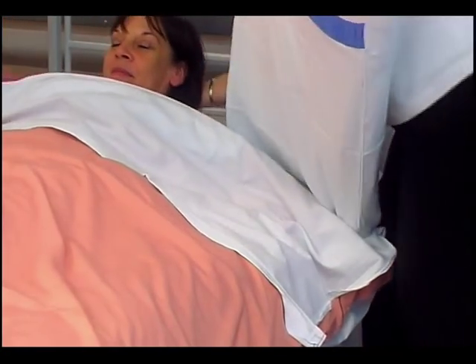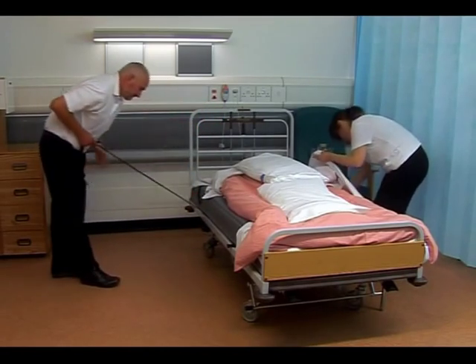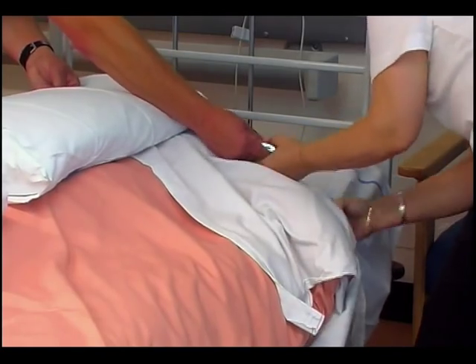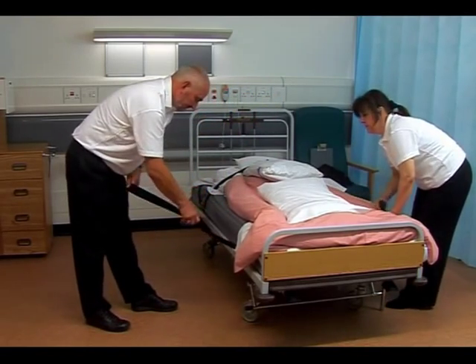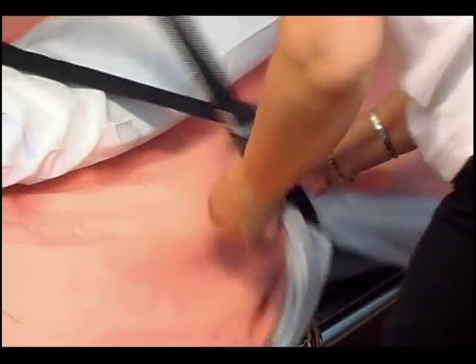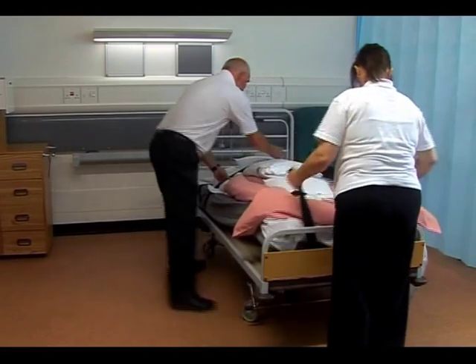Working in tandem, remove the cross straps from the corner pockets and pull out the end straps from under the mattress at the foot and head ends of the bed. Then tighten the cross straps across the patient. Use any available bedding, such as pillows and spare blankets, to help ensure that the buckles are made as secure as possible without causing discomfort to the patient or resident. Ensure that any loose ends are tucked into the cross belts to avoid potential trip hazards.